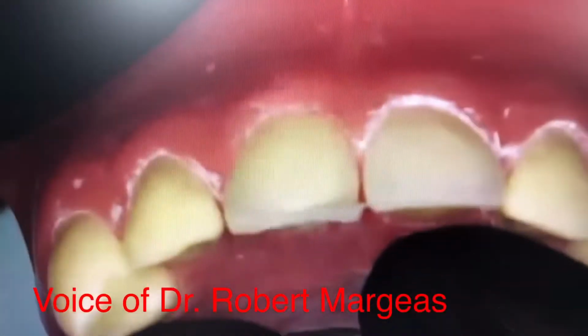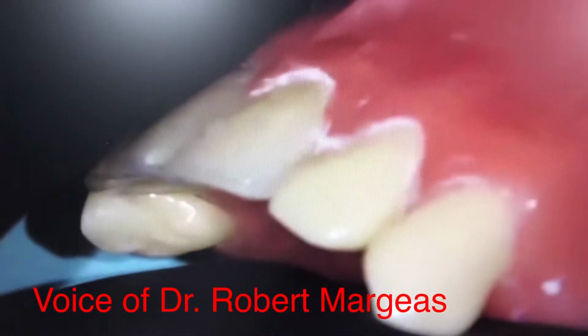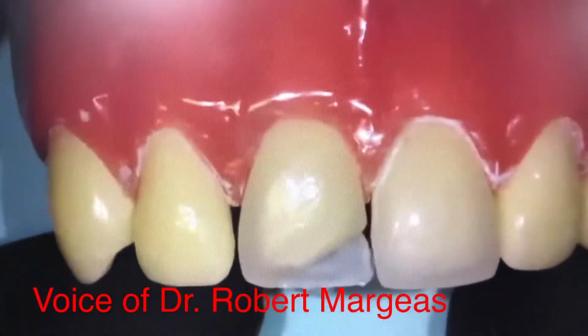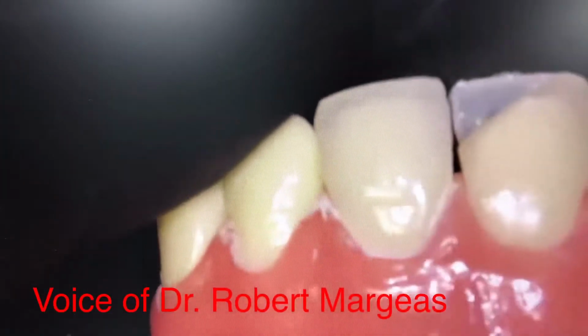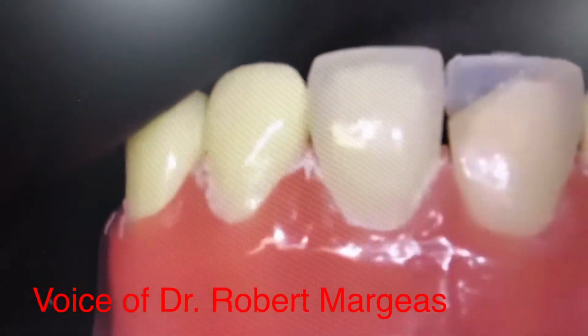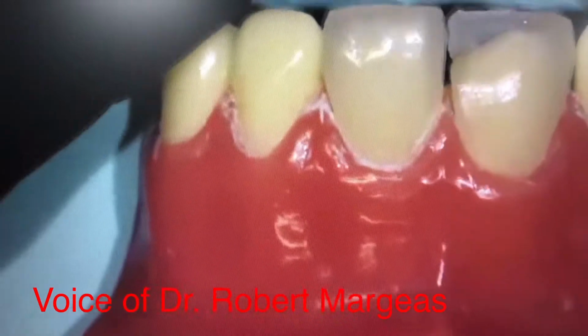Once again, the thinness of this lingual. You can see it does not come out to the facial. If it did, you would not have room for the dentin. Now, I want to create the translucency. Look at the translucency in between the teeth. So I have to keep the dentin out from going into the interproximal.